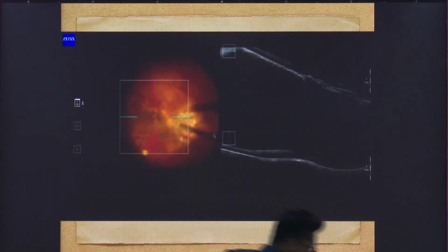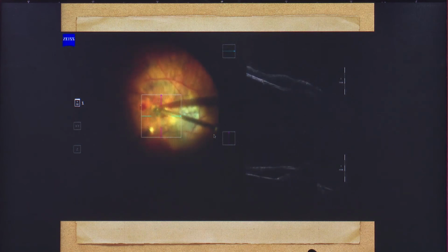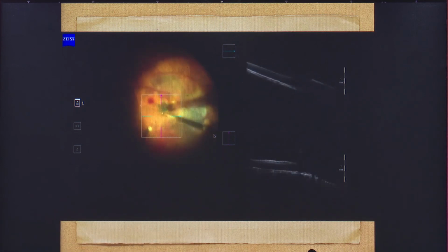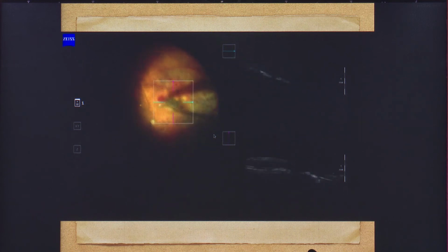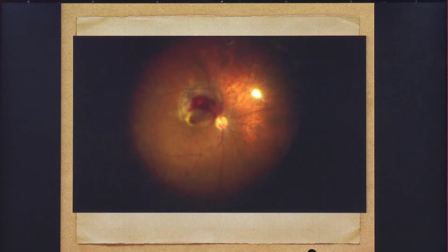And again, this is a myopic patient with a large macular hole. So I have stained it. I just wanted to say that these are difficult eyes, so you must stain them to see the ILM properly. But whether we have tucked this ILM properly into that large macular hole or not can be helped by the MIOCT, and it's very nicely seen when you're tucking it. You see the membrane come over it, and you know that you have done a good job and can close this case. Once you have brought the ILM over the large macular hole, after the fluid gas exchange you can see whether it's staying at the same place or not.